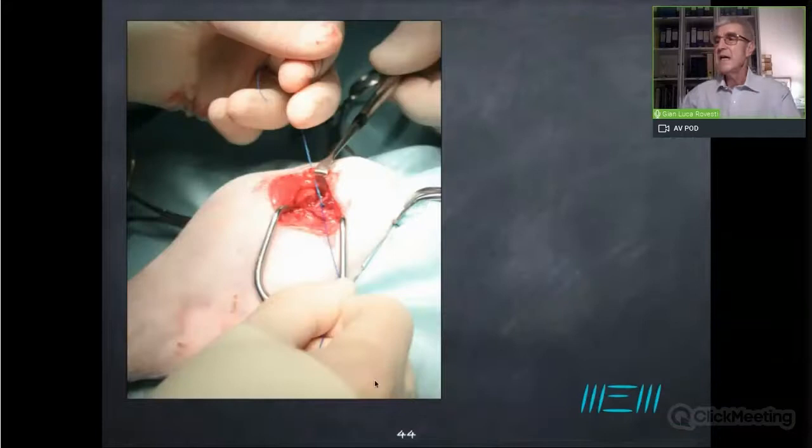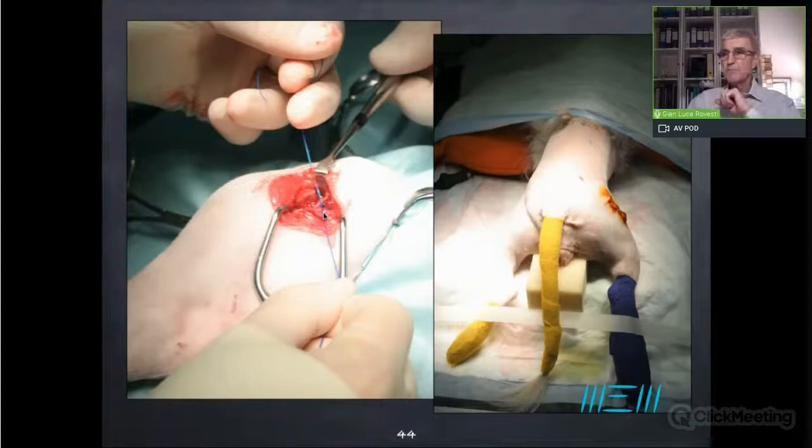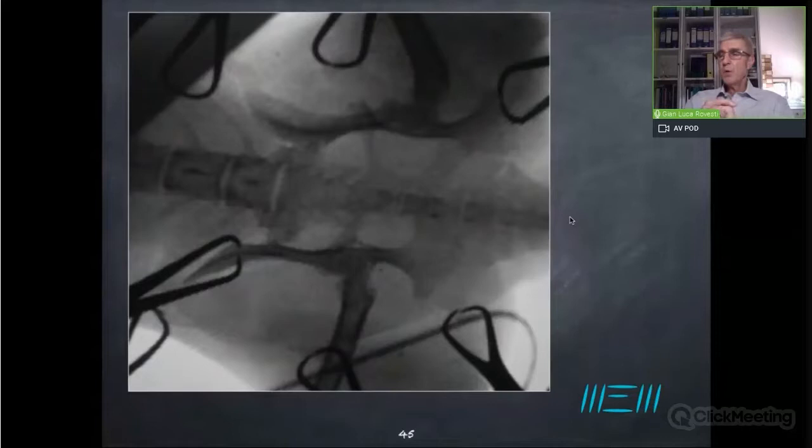And then you tighten the stitch like this. Very simple, very straightforward. If you want, you can put a couple of them as well. Small incision, a 15 to 20 minute procedure. Okay? Then we change the position and we put the position as we want. This is the surgical wound for reduction of the luxation of the hip, and then we will start with reduction of the sacroiliac luxation.